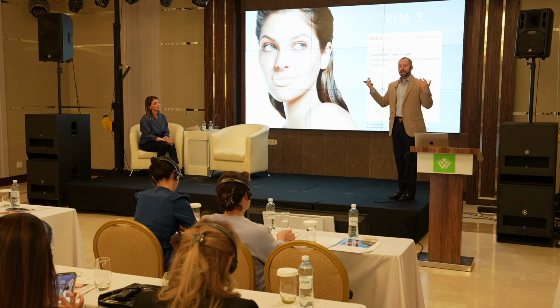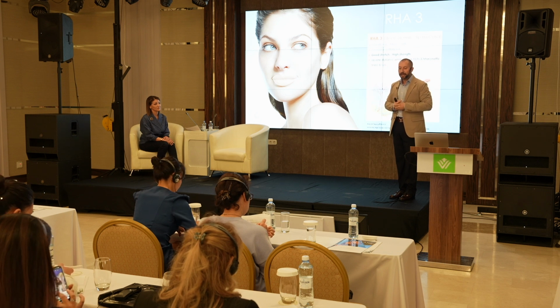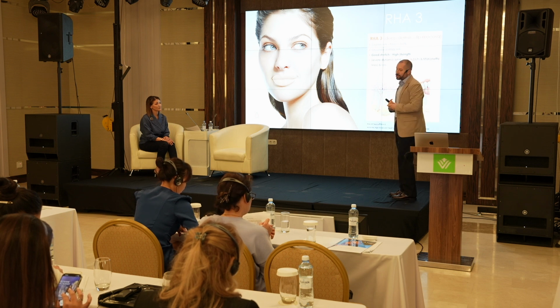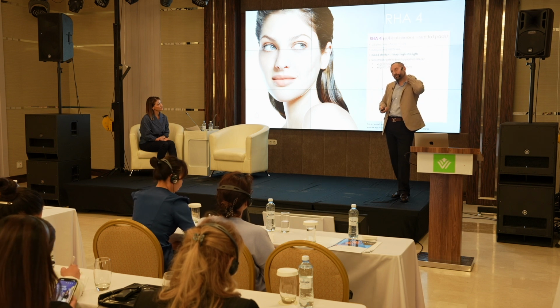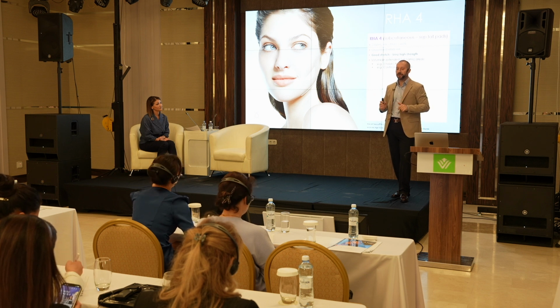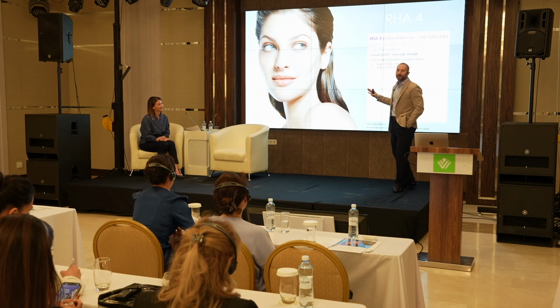Superficial fat, lips, nasolabial fold, marionette fold, everywhere. Forehead. RHA 3 is a really malleable product. You can see it also has a really low modification rate, 3.6. For the lip it gives a little more volume than RHA 2 when you compare. And then my second favorite products, or they can share the top spot, RHA 2 or RHA 4. I love it. RHA 4, you can use it everywhere also.